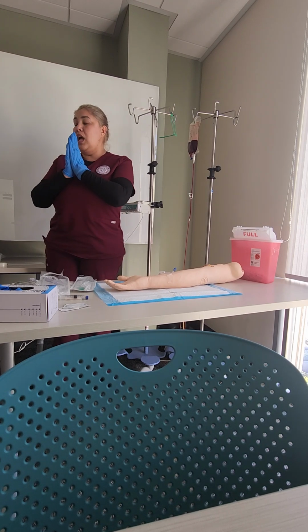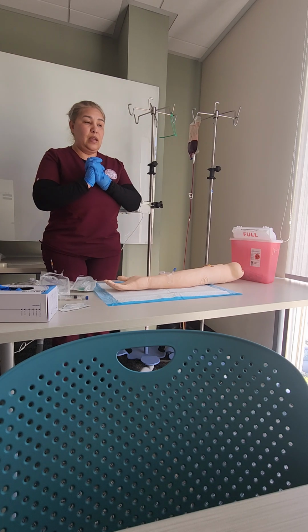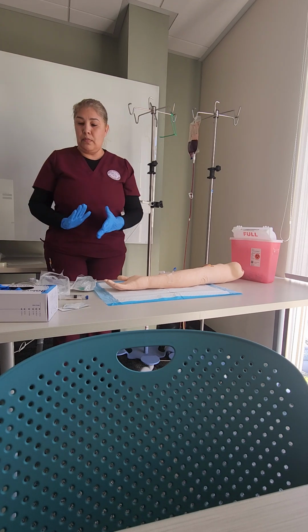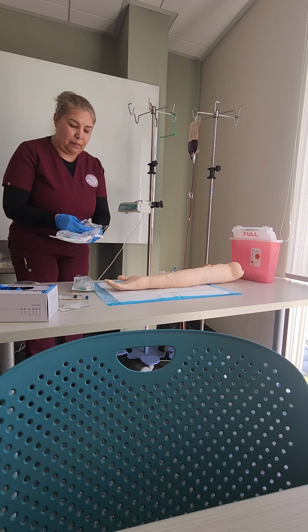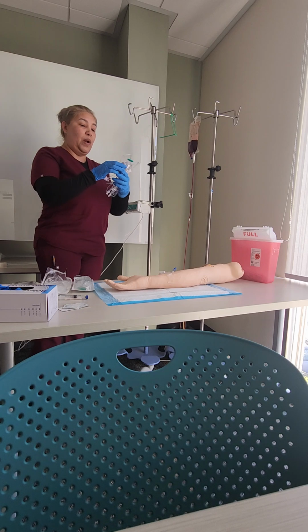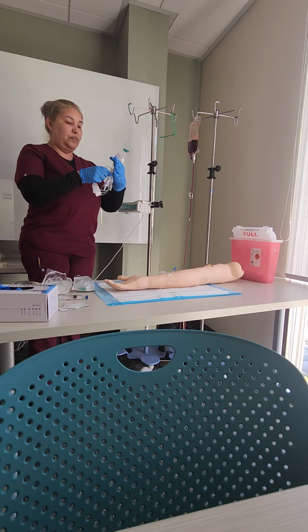I have checked that I have the right time for this antibiotic and hydration, and I also have given the opportunity for my patient to refuse. I will document the whole process at the end. What I want to do now is open up my IV tubing, maintaining sterilization. I do not want to let this touch the floor or anything else.